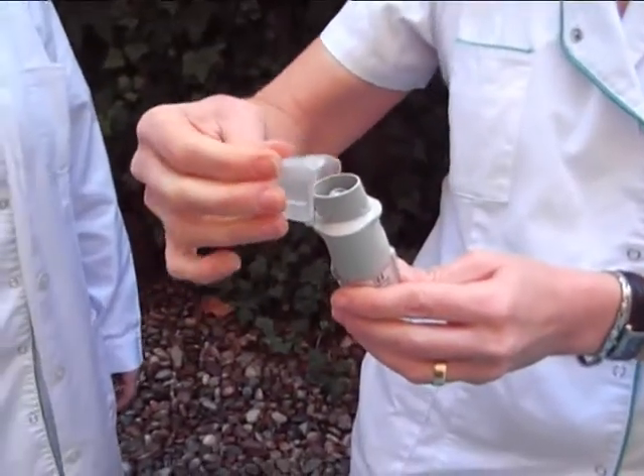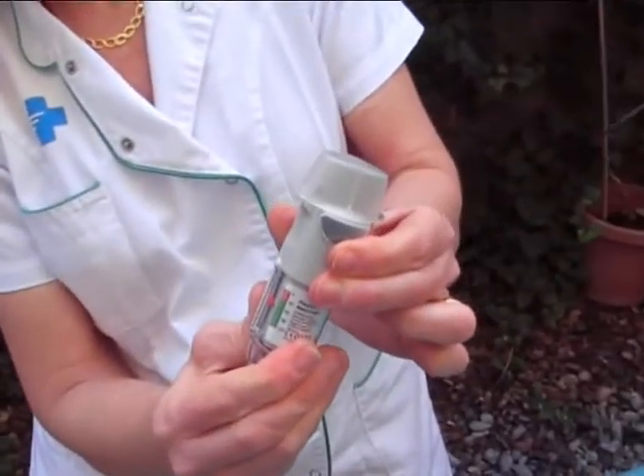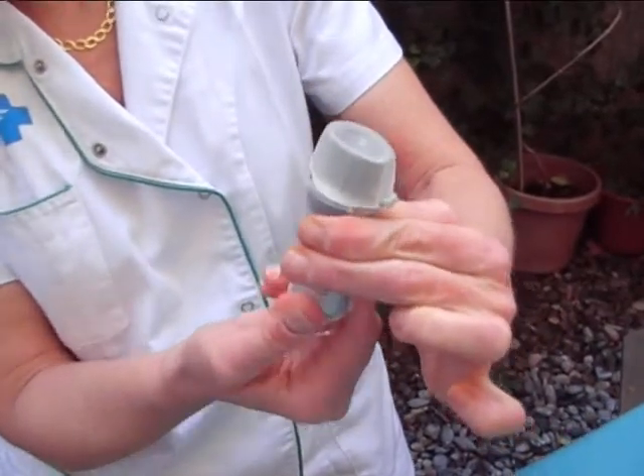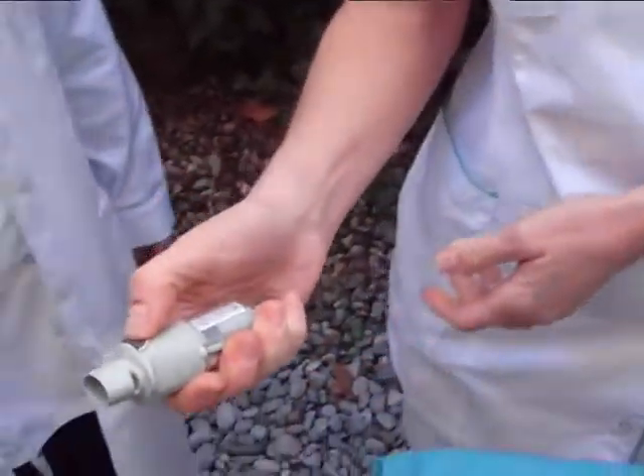Note that the red arrow indicates the remaining doses. When it gets to the red zone, it means there is a dose for one week. If the cartridge is new, you need to do this a further two times to make sure that the inhaler is ready for use.